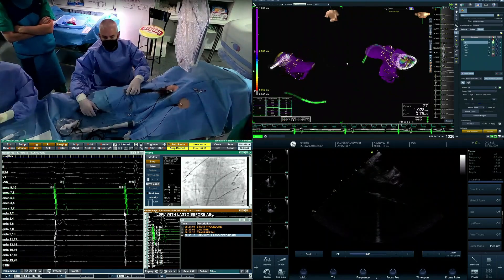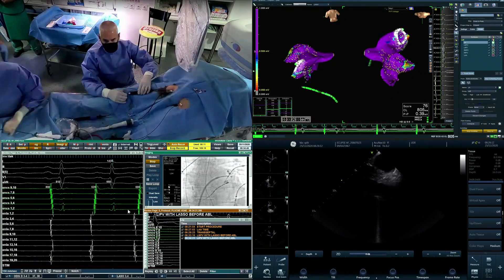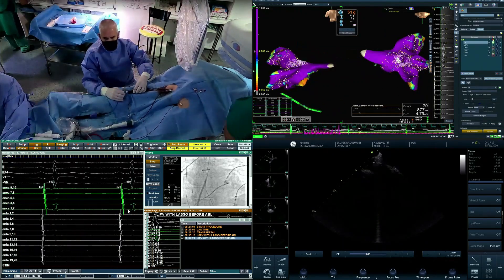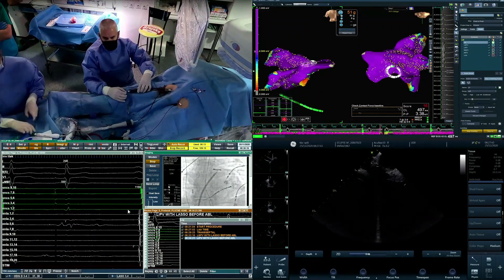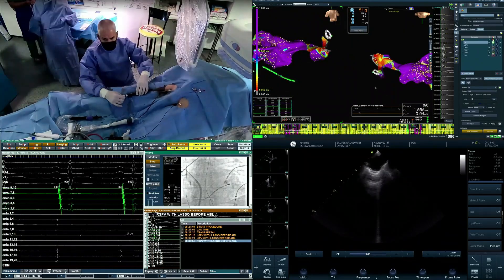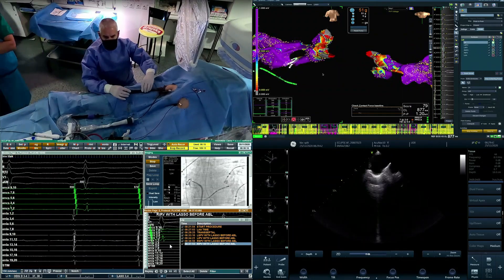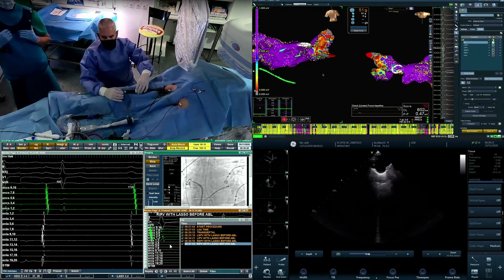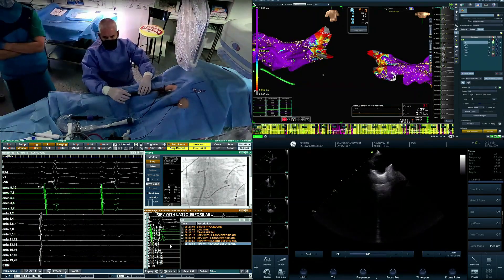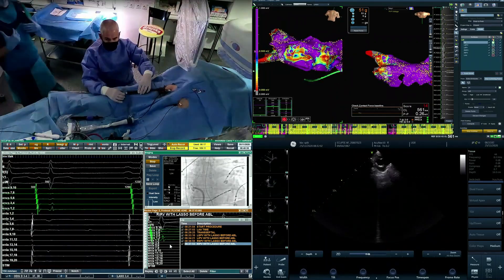This is patient number 23 in our experience in the Eclipse AF study. By that time we opted to do the setup as shown here. After obtaining left atrial access, we are entering the left atrium with a standard lasso catheter and we are collecting 3D left atrial geometry with the lasso catheter. Once we have a reasonable left atrial geometry, this would be our standard workflow within any other Navix case.